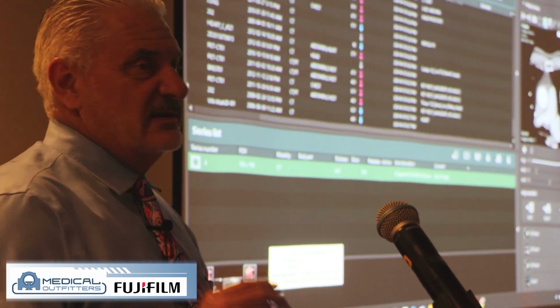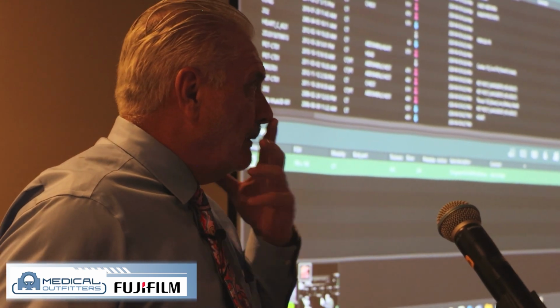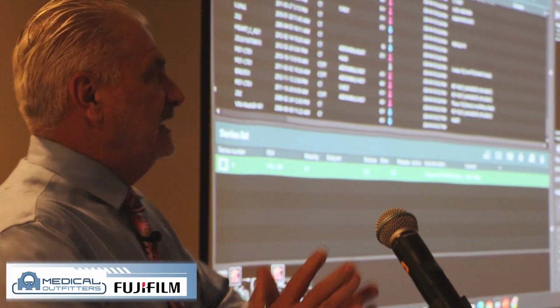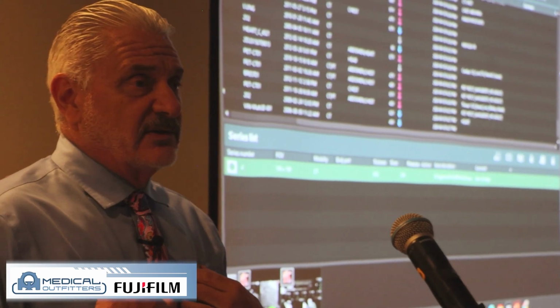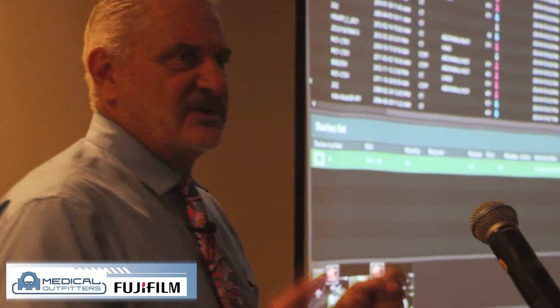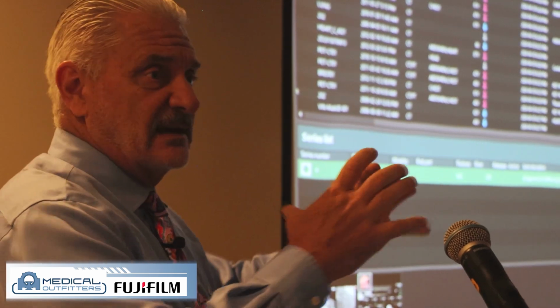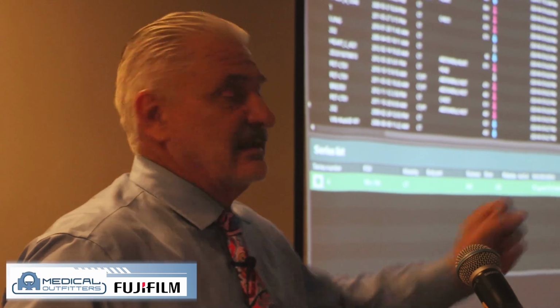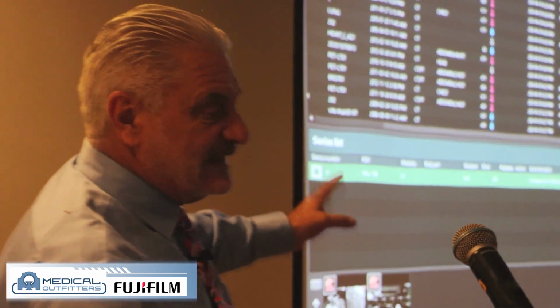Well, there's two different ways of working that, right? So you said you're doing cardiac studies. Do your technologists do any of the reconstructions for you? And they save what you ask for. And that's the way I was taught. So, right, I'm a technologist. I consider myself the butcher. Sounds silly, right? You're giving me this piece of meat, and I'm going to take this data set, which is like a big loaf of bread, and the radiologist has already told me what cuts they want. So my goal is to be the best that I can be and go and save these.